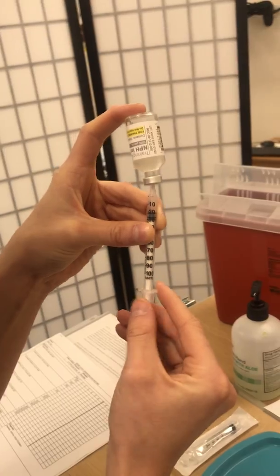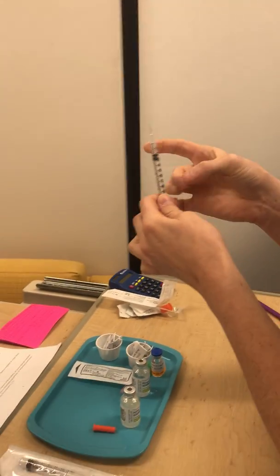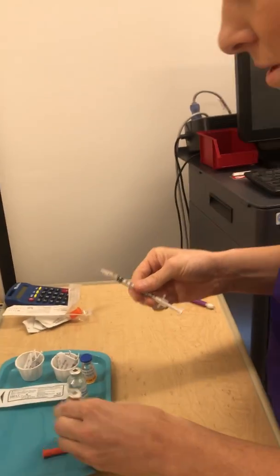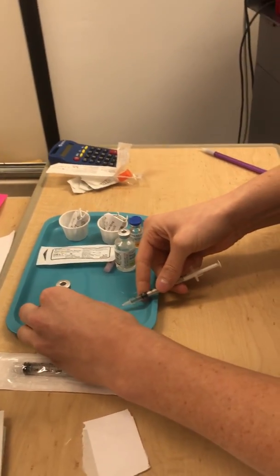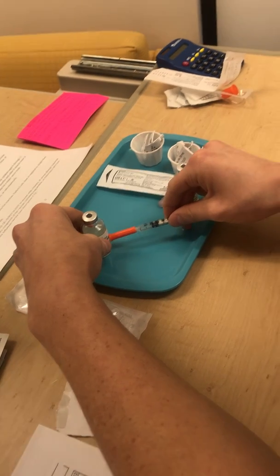Perfect. Tip up. And that's exactly 21. Any bubbles? Oh, and then I'm going to put the cap on with a hard surface here. And then my other nurse is watching me.